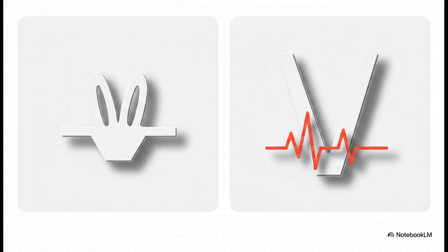But a left bundle branch block creates a deep negative canyon in V1 and a broad positive wave in V6, completely disrupting the normal septal depolarization sequence. And here's exactly why this matters for our infarction investigation. An LBBB wildly distorts the ST segments. It makes it notoriously difficult to spot an active, ongoing heart attack hidden right underneath it.